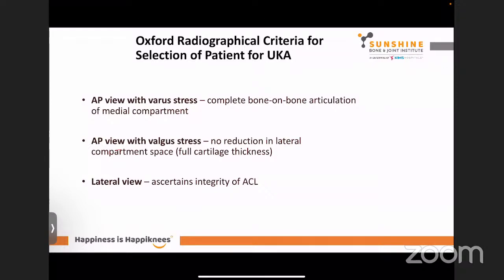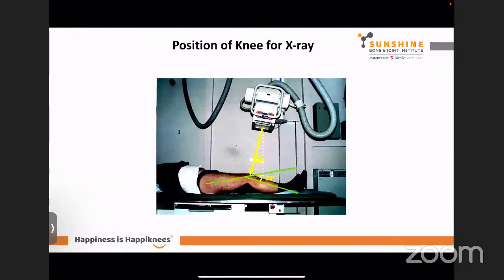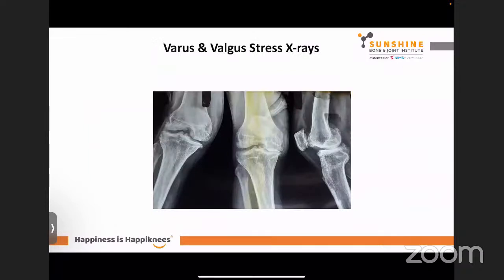And the lateral view gives you some idea about whether the ACL is intact or not, which I will show you. So for the position of the X-ray, put the knee in slight 20 degrees of flexion, and the X-ray beam comes at around 10 degrees of caudal tilt like this. Okay, this gives you the best view, and you get varus and valgus stress X-rays. So this is a valgus stress. There is no reduction in the lateral joint space.